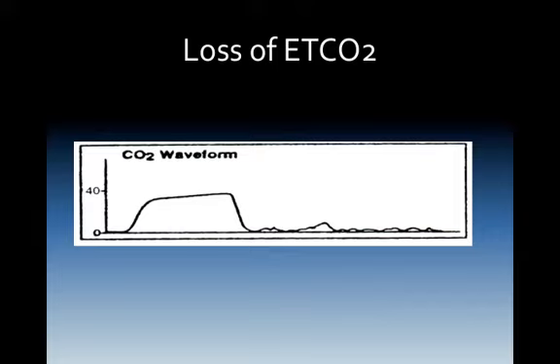Low levels really rapidly could mean total obstruction from a mucus plug, or mucus plugging that would be partial. If you started to see it stair-step down, which we'll talk about here in a little while, over time, they may have a partial mucus plugging. Capnography malfunction. Now, if there's vomit that entered into the side sampling, all of a sudden the machine cannot see the gas sample. So a lot of things can cause this.